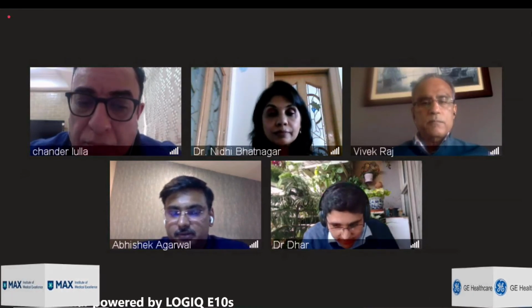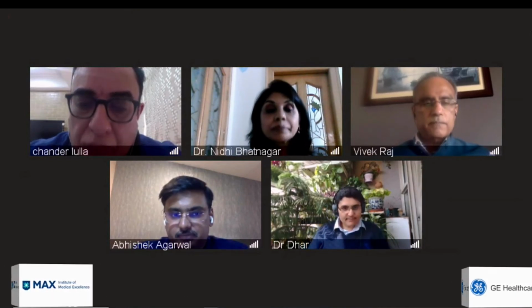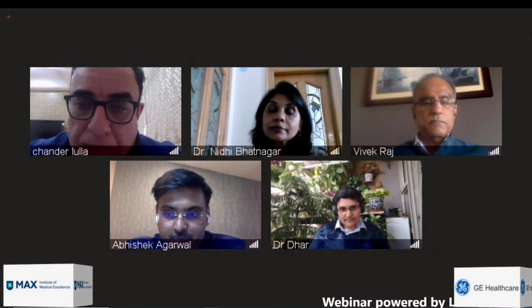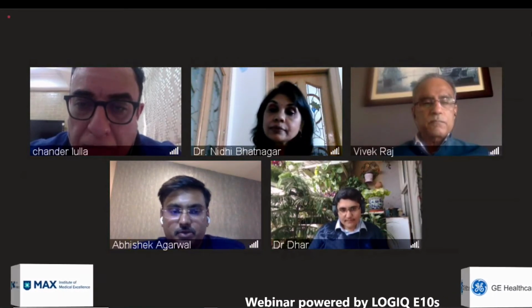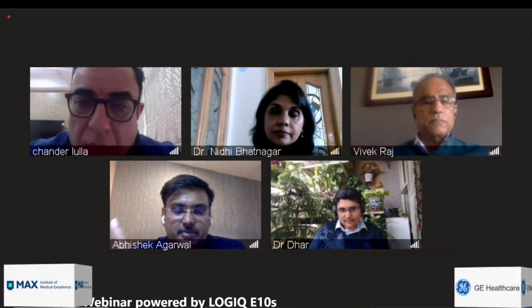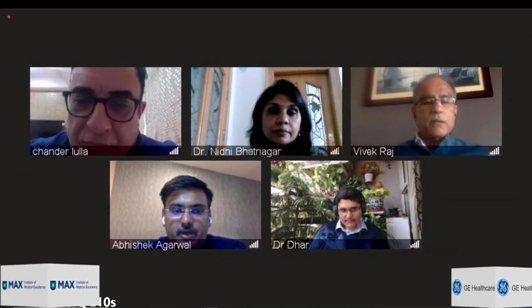So suppose, Abhishek, if you send me an elastography score of 20, I'll put an endoscope in. Correct. But I do get follow-ups asking for elastography values in patients who are already frank cirrhotics, already 30, 35 values, who come after a year just to know where the value is going. So I don't know how relevant that is.